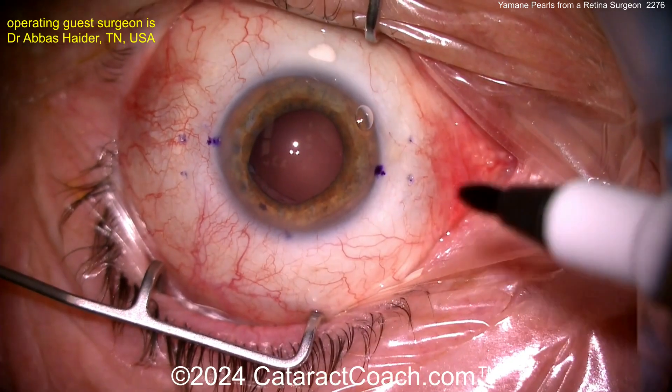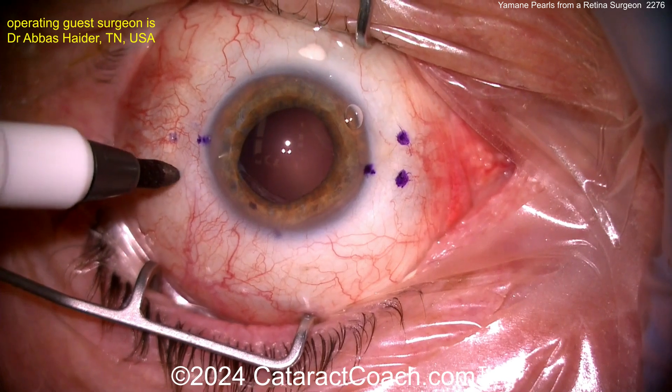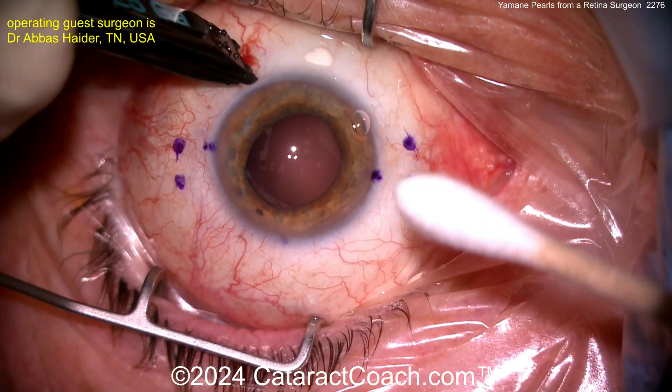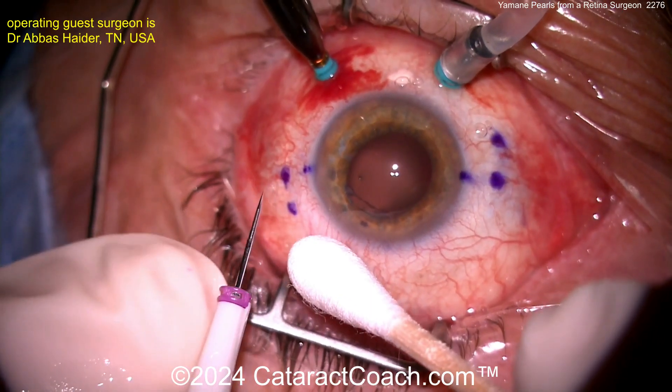Our guest surgeon here is a retina surgeon — and remember, Yamane himself is a retina surgeon. By doing a complete pars plana vitrectomy here, you're really able to have a lot more success with this procedure. Our guest surgeon has decided he's doing a lot of these procedures.